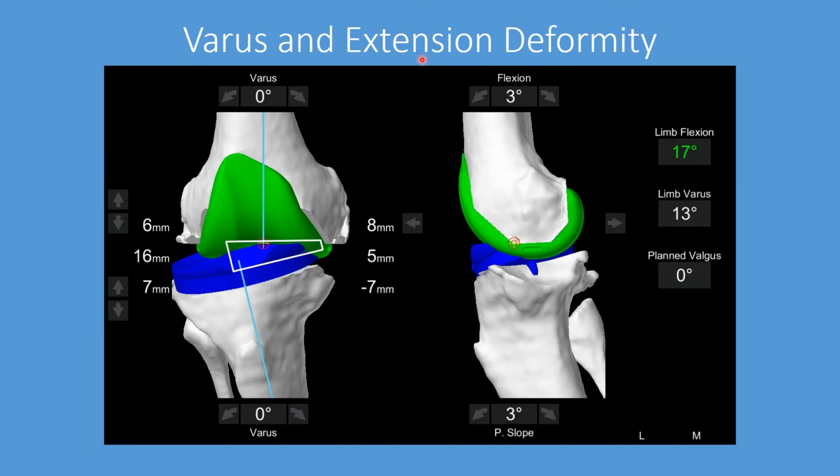We'll look at the knee under anesthesia to determine the extent of the deformity in both extension and in flexion. So I'll show you extension first. So this patient has a Varus deformity, so the knee is bow-legged, and we can see that it's come off to the side. But most importantly, we can see that there's an asymmetry. There's 16 millimeters of opening on the lateral side. Here's the fibula, this is lateral, and only 5 millimeters of opening on the medial side.